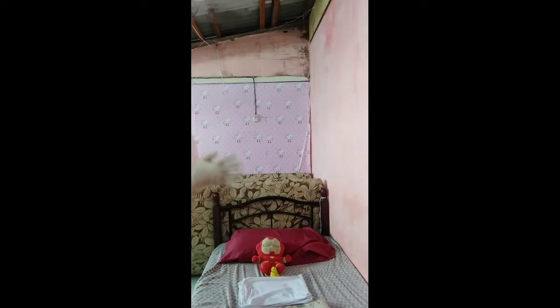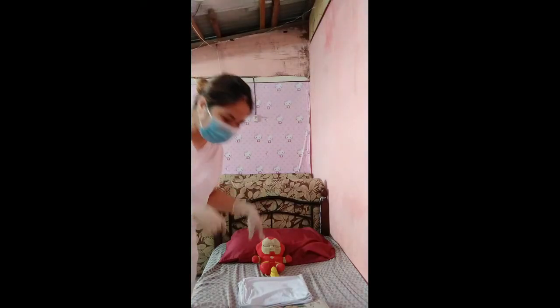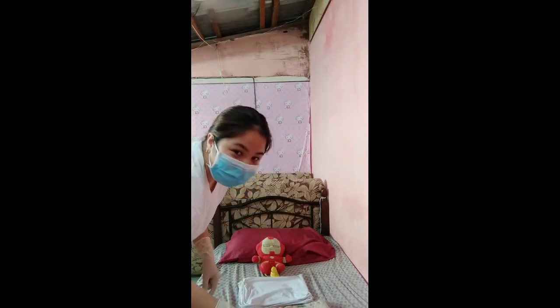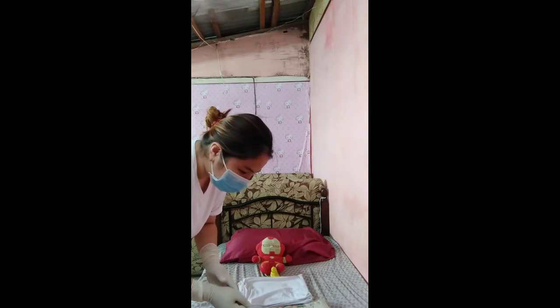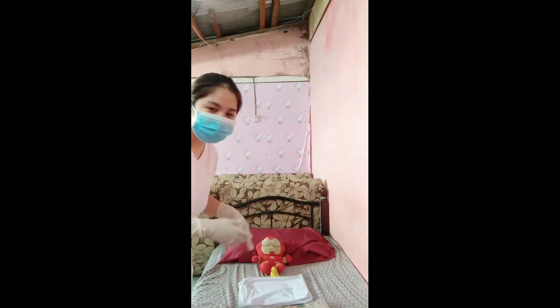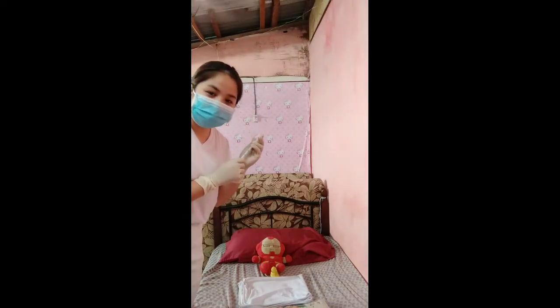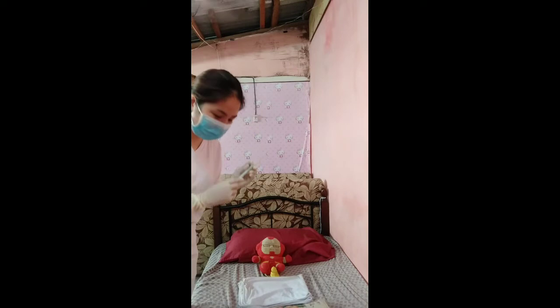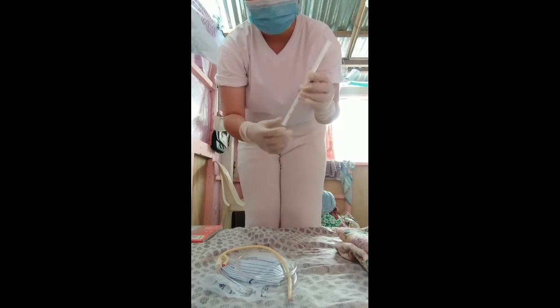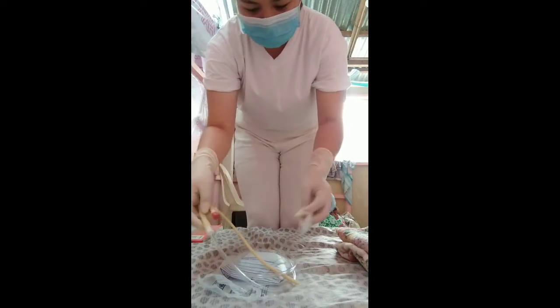Good. And after that, we need to prepare the antiseptic solution for cleaning the meatus of the patient. So I have here the alcohol swabs, 3 alcohol swabs. After preparing the alcohol swabs for cleaning the meatus, we need to attach the 10 cc syringe to the catheter port. This is a 10 cc syringe with water. So we need to insert this into the port of the catheter.